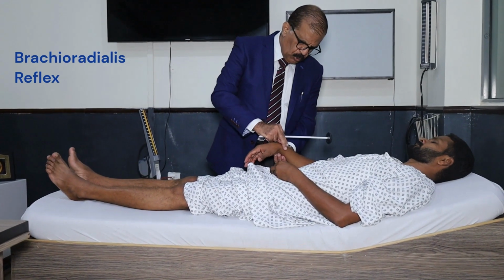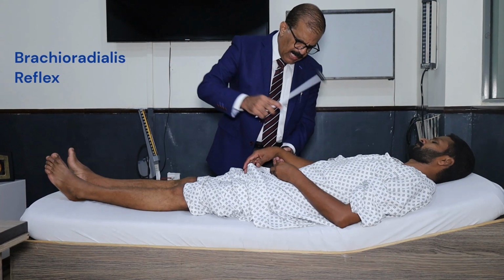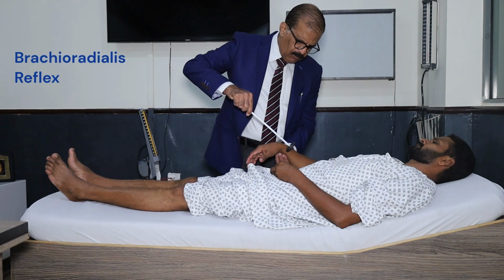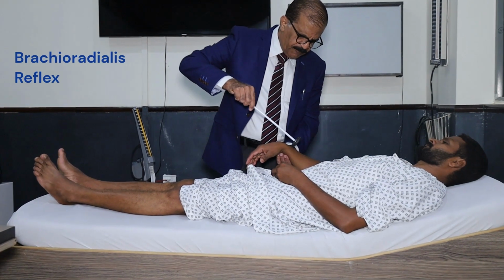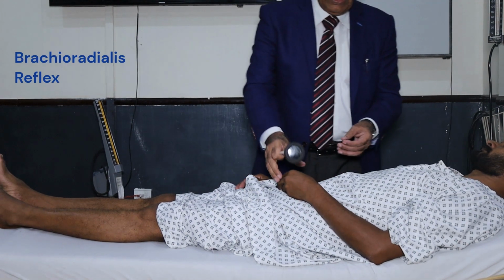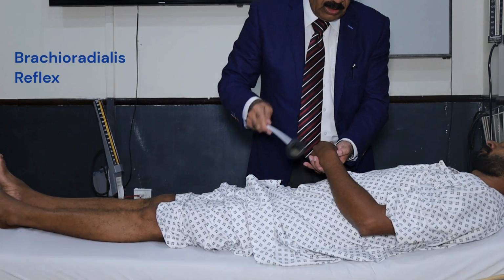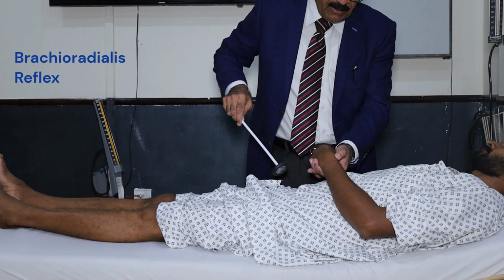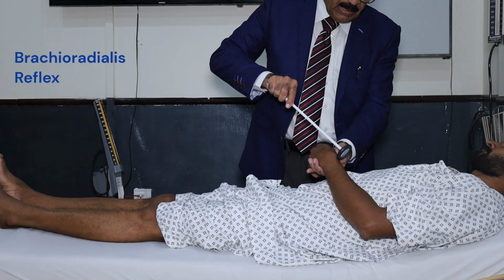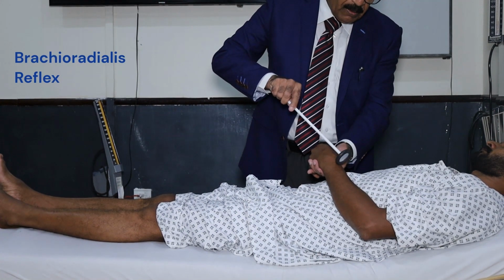I think the best way is to first locate the tendon. This one is the tendon, and I put it here, and then I lift it and do it. You see this movement? Try to be as gentle as possible. Typically we do it twice, like this. On the other side, this is the tendon. I'm first going to put it here and then slightly lift it. See this movement?